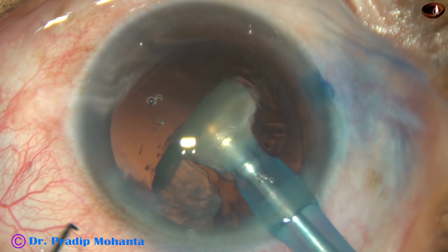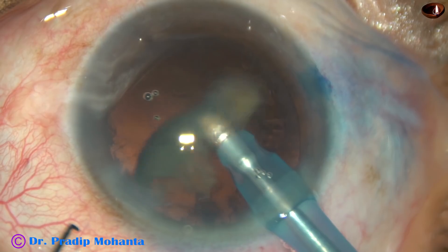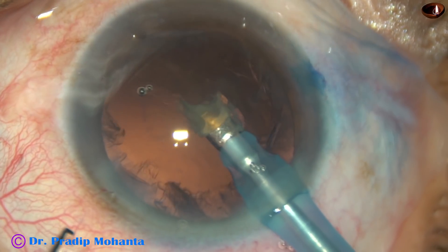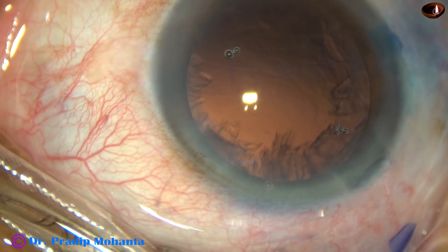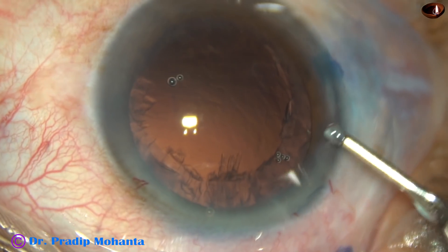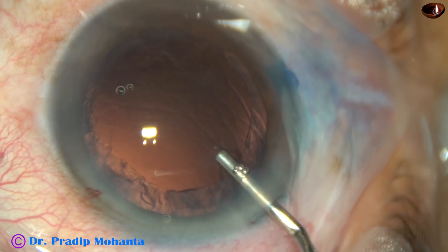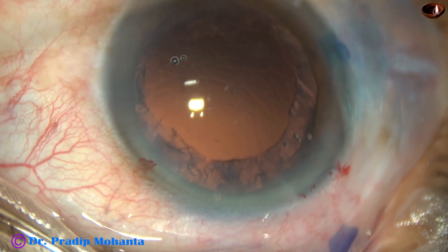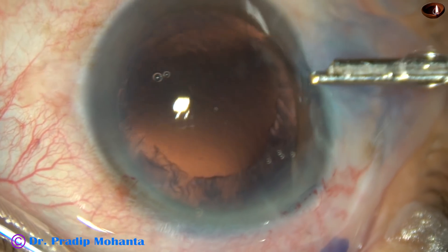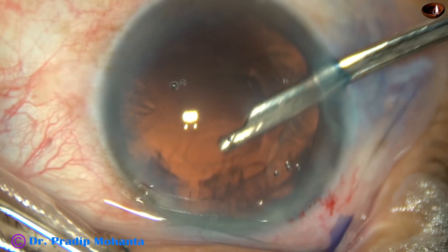This is the last bit of the nucleus. At this time, I have removed the chopper so that the anterior chamber becomes more stable. And now, cortical cleanup is to be done. This is 2% HPMC. Now, a 23G Simcoe cannula is being used to remove the cortical matter.